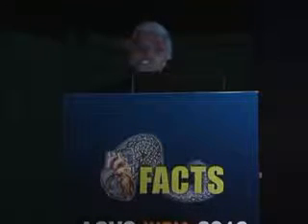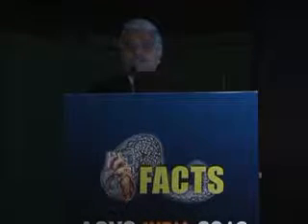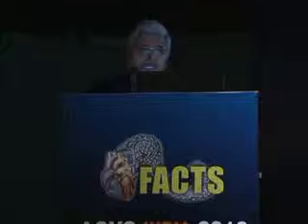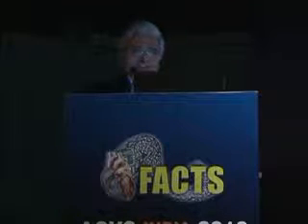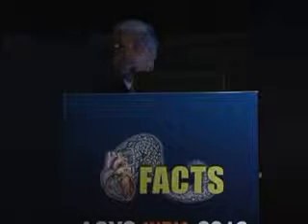This procedure is not without complications. You could have the device or the coil migrating. There are instances where my friends have had, and the literature has reported, where the coil has retracted even into the left main, causing death. So you could have extreme complications too. But these are readily imaginable complications.